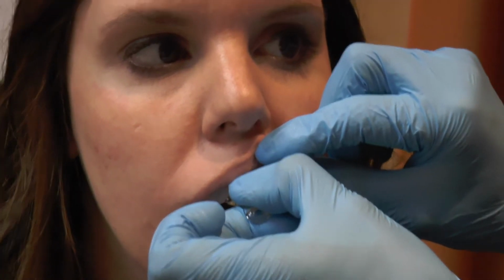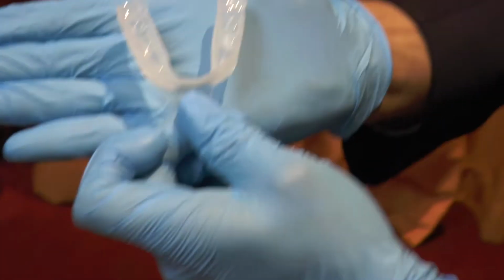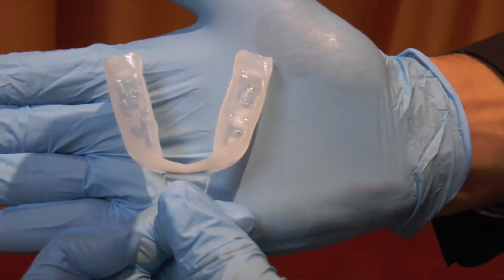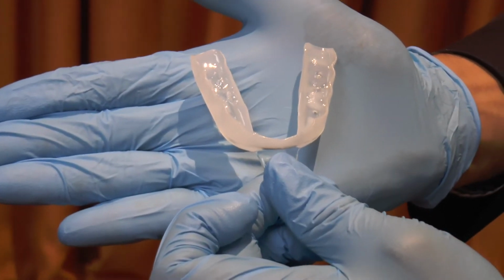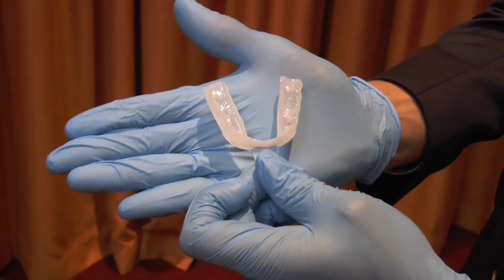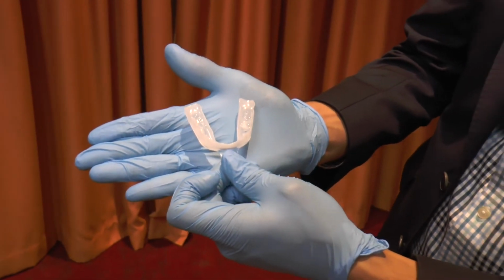And what you'll find is once removing it, you'll let it sit on the bench to completely set up. Now in the office, a better way to speed this process up is if you have an air water syringe tip. By having air blown over it, you'll get it chilled quicker. Therefore, the patient does not have to keep this in the mouth for a long, extended period of time. Or you can give them a cup of cold water that they can hold in the mouth to just speed up this process. Okay?